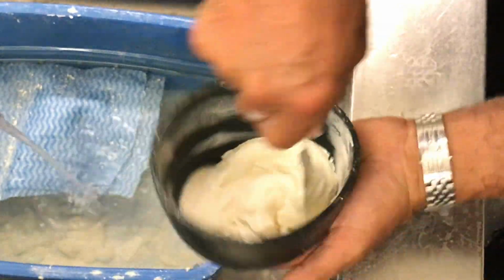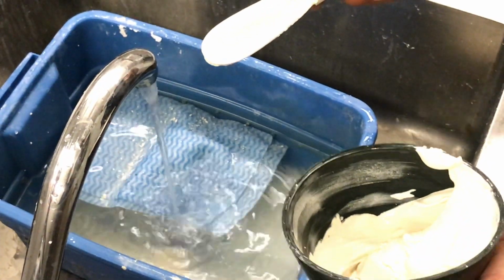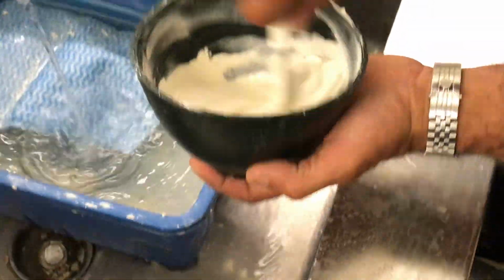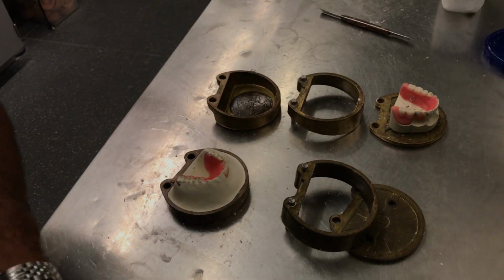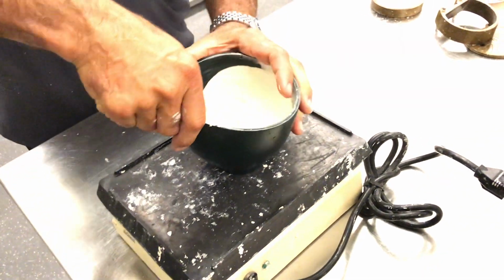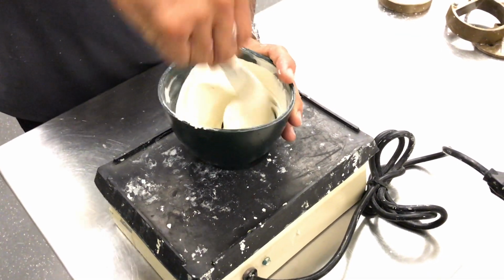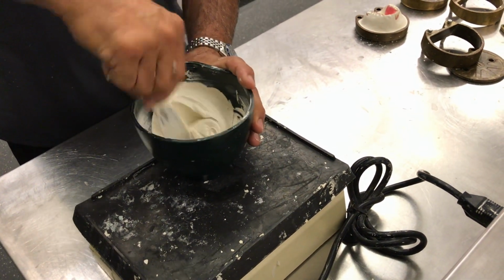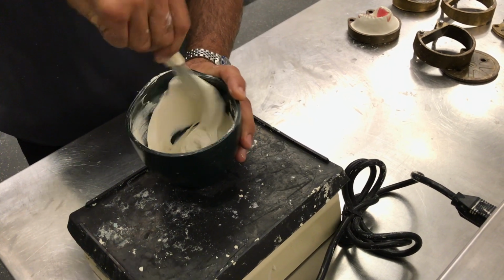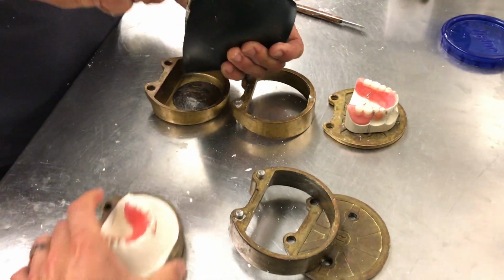Notice that if you need to add a little bit more water, I don't take it over the sink. I can just wet my spatula a little bit. Quite often, just a little moisture is sufficient to give you the right ratio. You can certainly measure it, but I think over time, a good eye goes a long way. So about 30 seconds of spatulation over the vibrator to make sure that we have a nice mix.